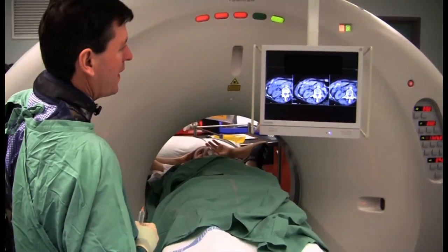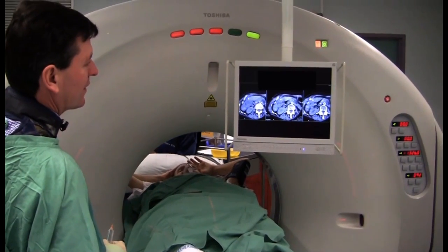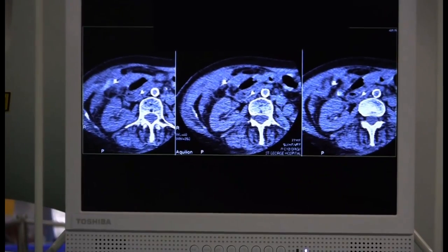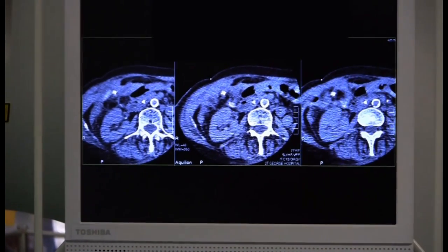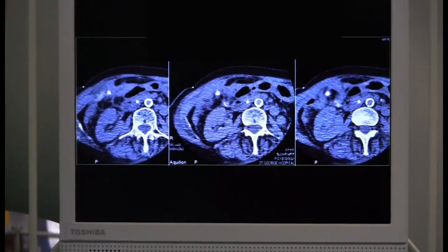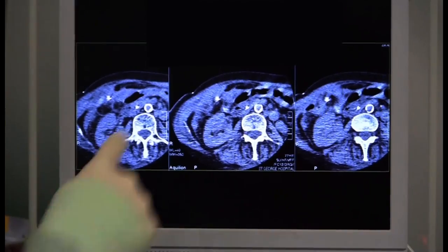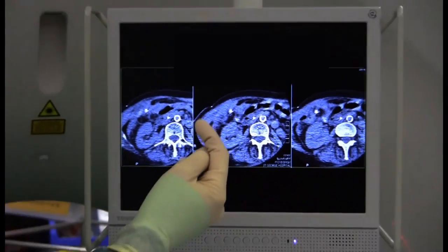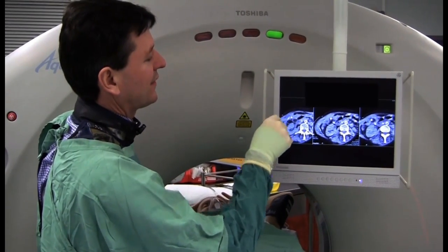I'm just having a think now about where the inferior extent of the collection is and where I want to enter that. I'll lay the 25-gauge needle across the skin in the usual fashion. There are some complications here — I've got a stoma site that I'm trying to avoid. The purpose of this is to get the position on the clock face in the XY plane, but simultaneously I'm contemplating how much further down towards her feet we need to start so that when we angle in, the needle tip will arrive roughly where I want it to be.